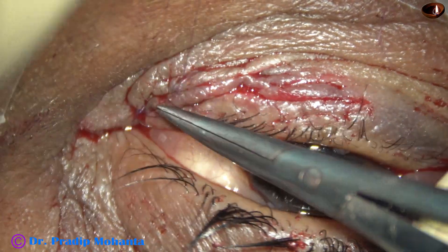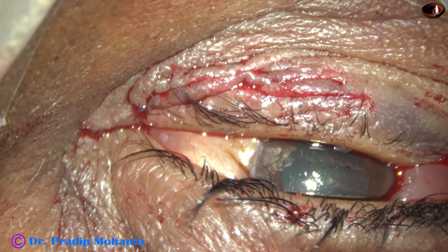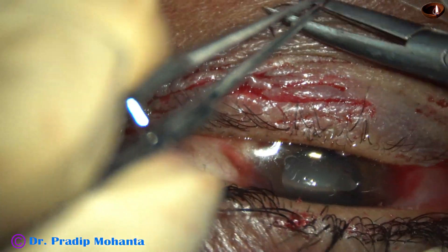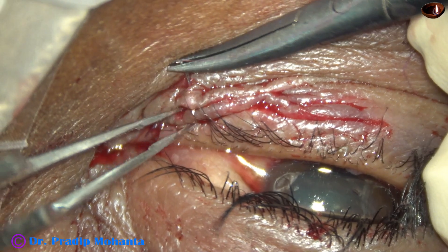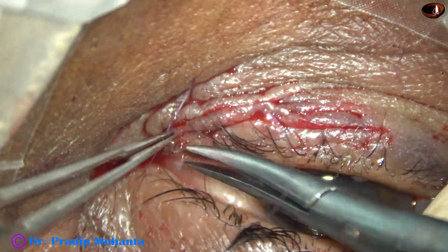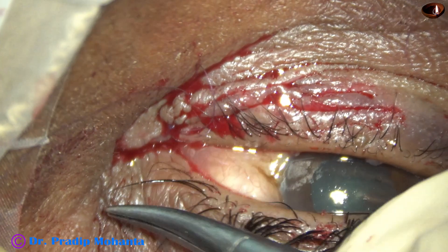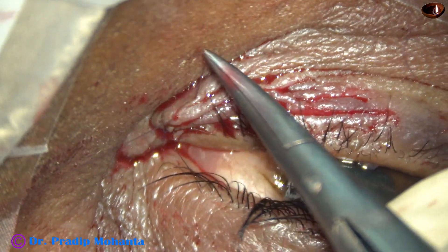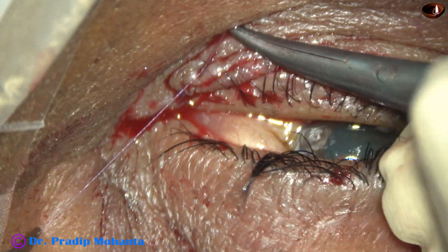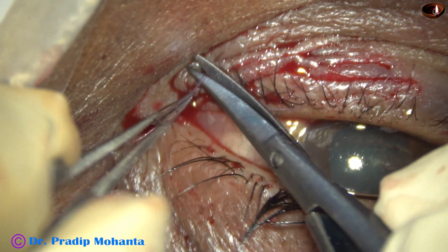See how nicely the two raw surfaces are opposed. This is the final mattress suture to oppose the two raw lips. The idea in repair of skin wounds is just to oppose the wound margins close to each other, but don't make it a very tight suture.